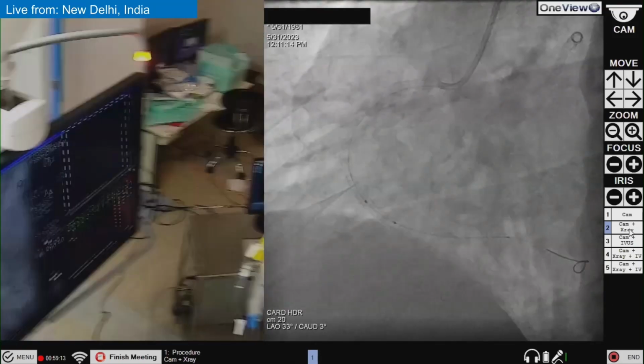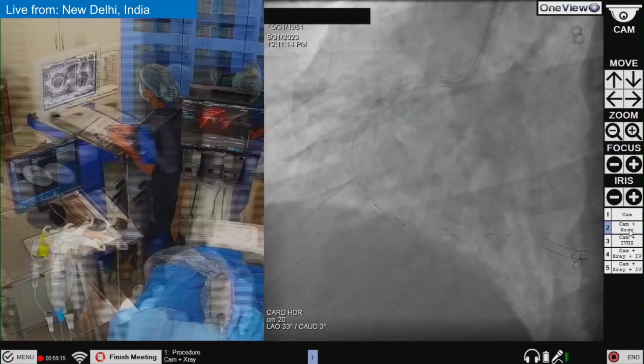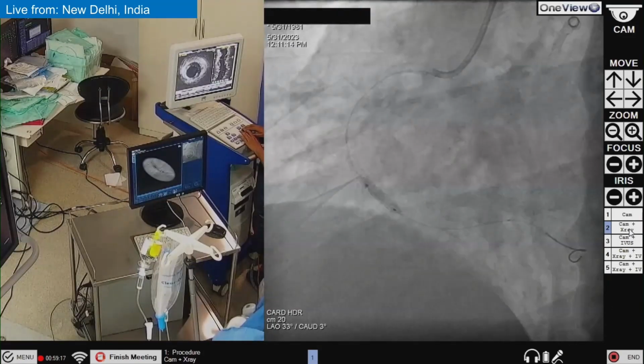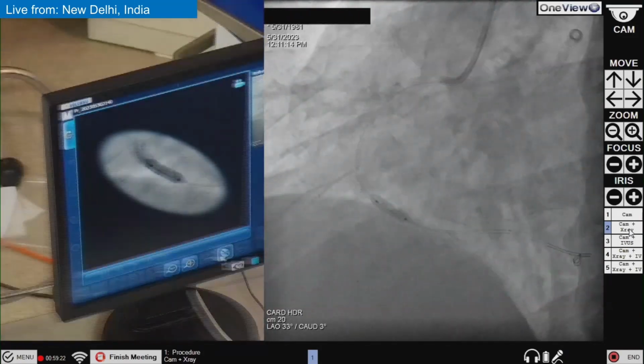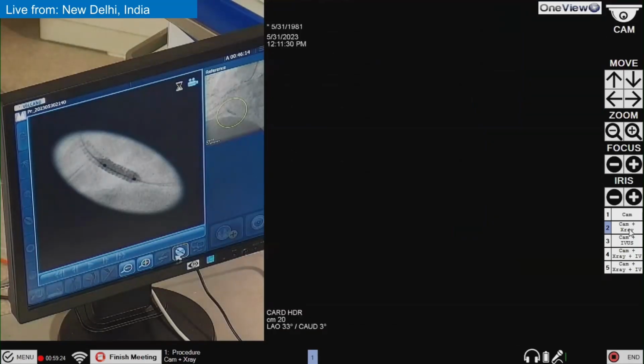Yes, okay. Quite good. Okay. Yeah. So we are in good position. Go up, please. 2, 4, 6, 8, 10, 12, 14. Okay, deflate.